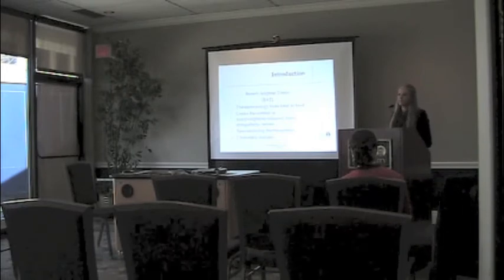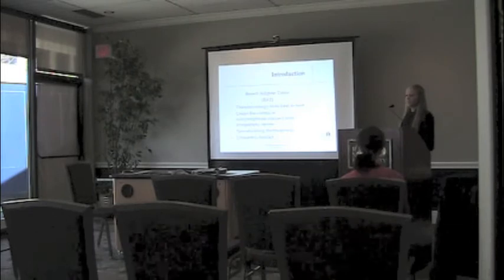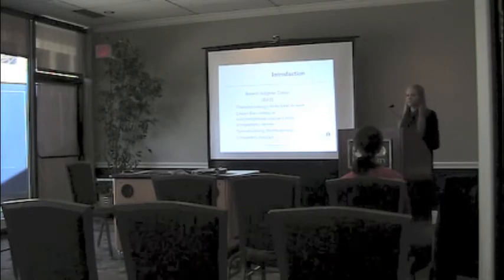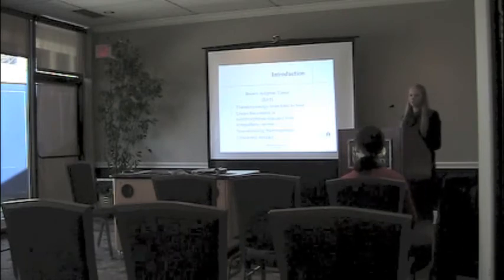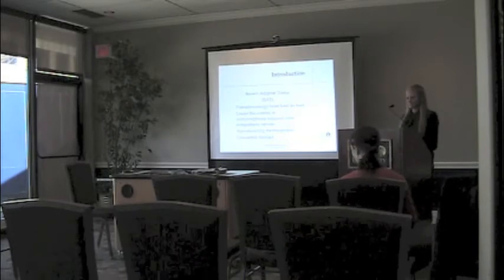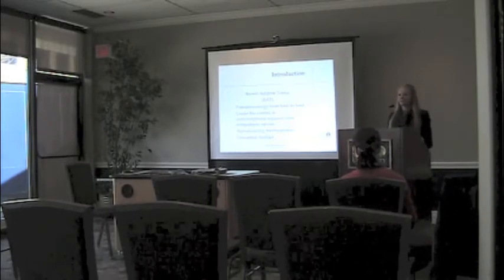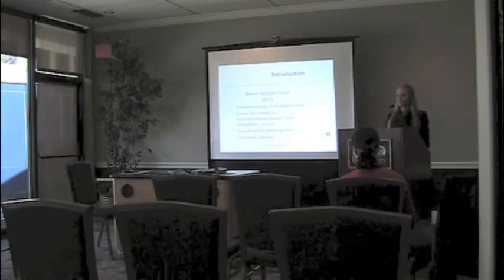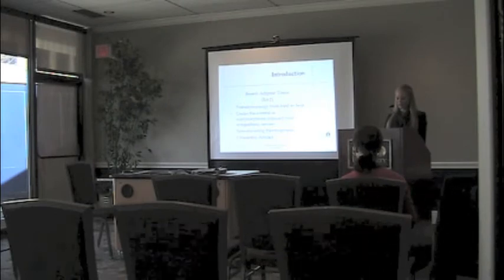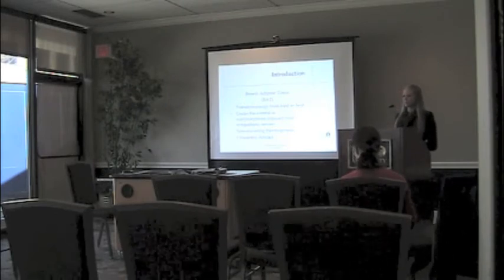Brown adipose tissue is what I'm going to refer to as BAT throughout this presentation from this point on. This is what transfers energy from food to heat within our body. It is under the control of the norepinephrine released from sympathetic nerves, and this is our non-shivering thermogenesis. So before our body lets us shiver, this is something that's going to help us not shiver. Because of this, it is an unwanted artifact that we do see in PET-CT.